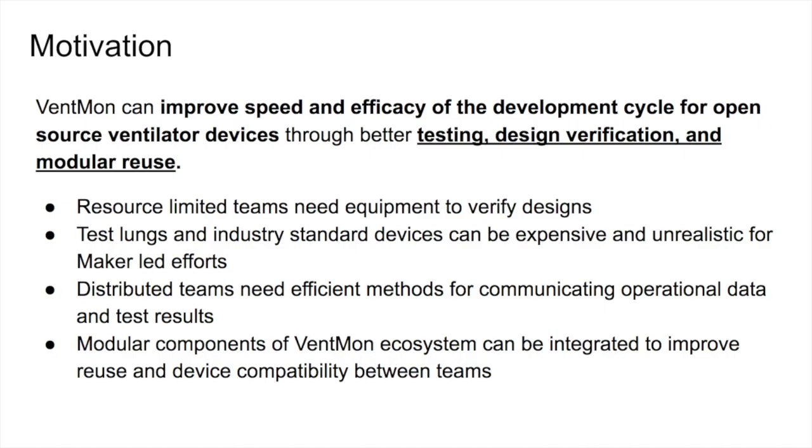No one team is going to have the perfect solution to the ventilator crisis. So by thinking in more compartmentalized ways and breaking down the overarching idea of a ventilator, we can hopefully have many teams solving small parts of the problem coming together to ultimately deliver a more effective and better tested device.